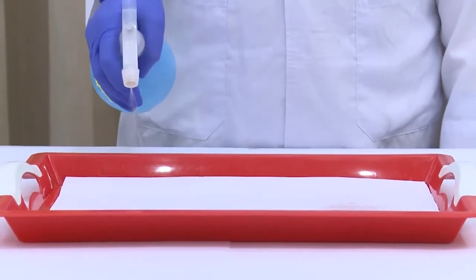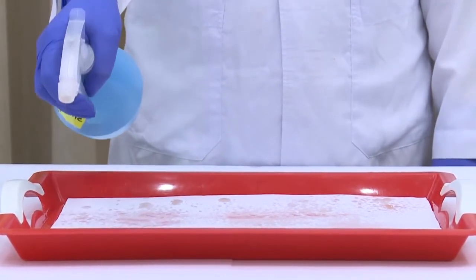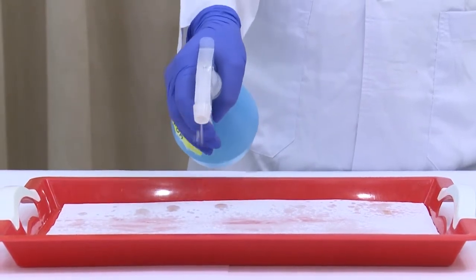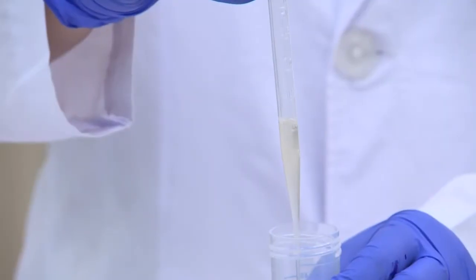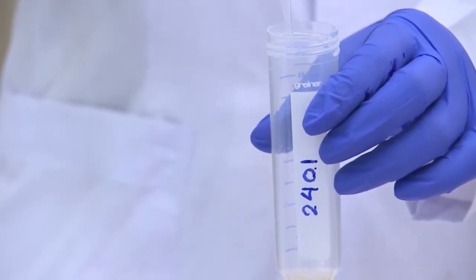First, place an absorbent paper on the sample preparation area and then spray 1% sodium hypochlorite solution on it. Transfer sputum from leak-proof sputum container to a 50 mL falcon tube.